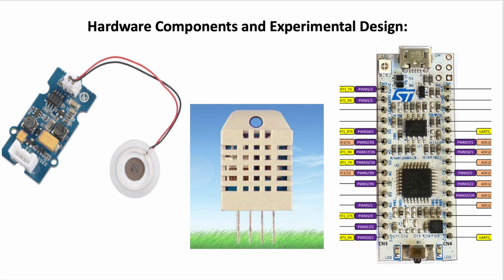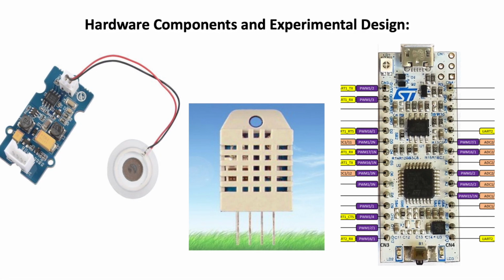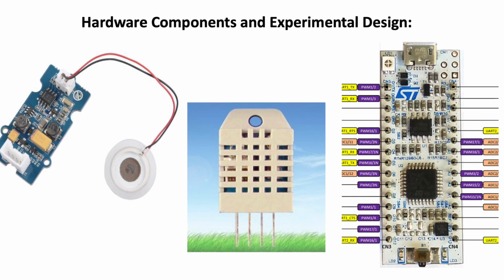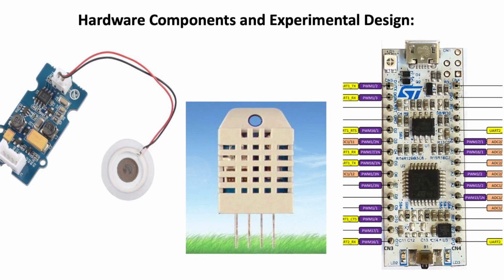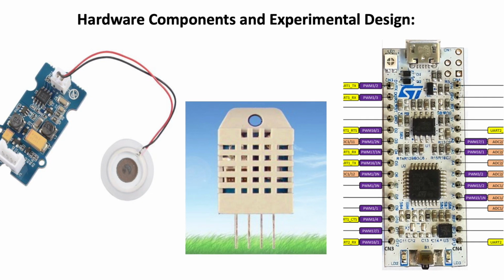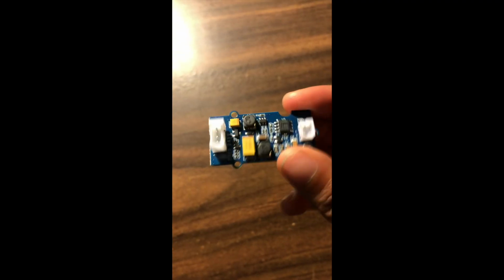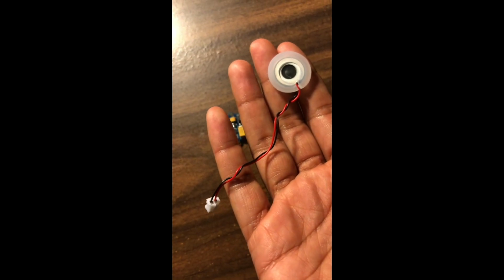For my experimental setup, I have three main hardware components consisting of my digital relative humidity and temperature sensor, the Nucleo microcontroller, and a special purchased Arduino part called the Grove Atomizer, which is a DIY humidifier. The Grove Atomizer is basically made up of two components, a driver board seen in blue and an atomizer, which is essentially a piezoelectric transducer, which is seen in white.